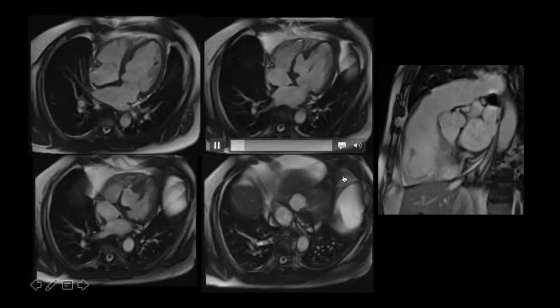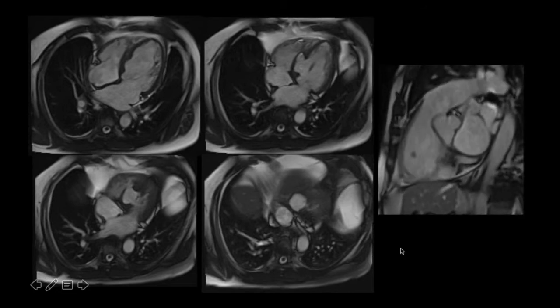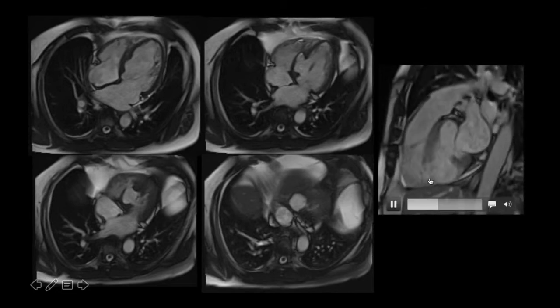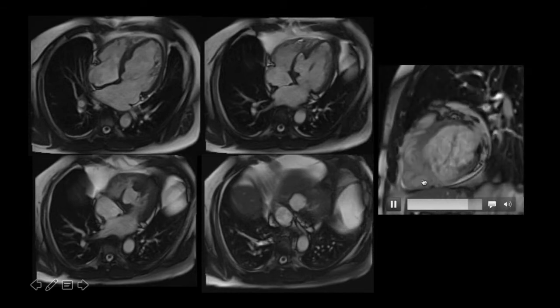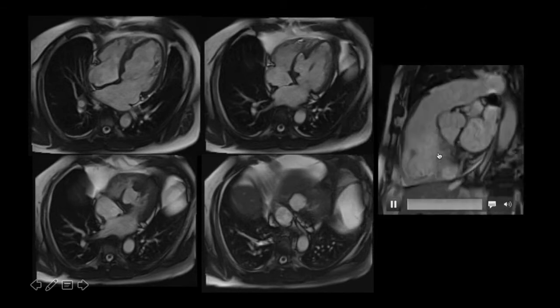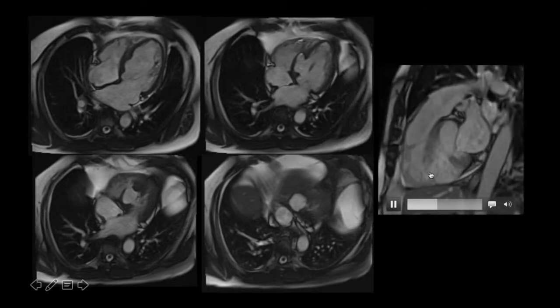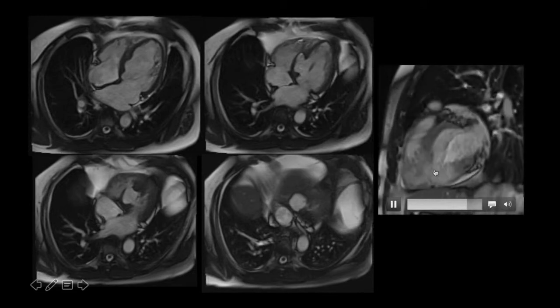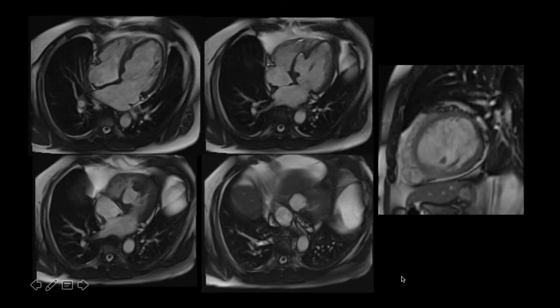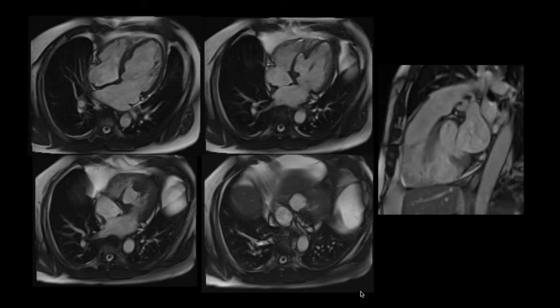And I think I'll just stop these so I don't crash my PowerPoint and run this. Again, you can see this little jet coming from the left ventricle through the aneurysm into the right ventricle. So this is a VSD, and the wall of that aneurysm is akinetic and very thinned.